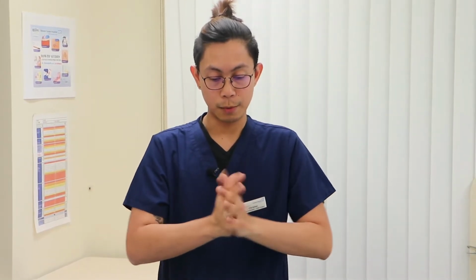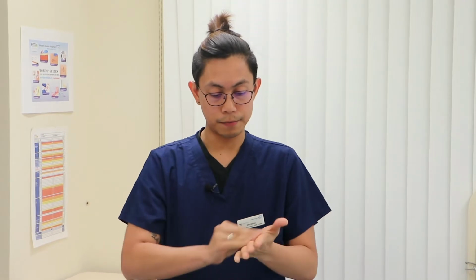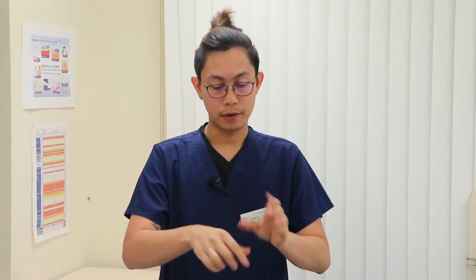Back of my fingers with my fingers interlocked. Rotational rubbing of the tips of my fingers against my palm. Vice versa. Rotational rubbing of the thumbs and wrists. Once my hands are dry, I can now approach my patient in a calm and professional manner.